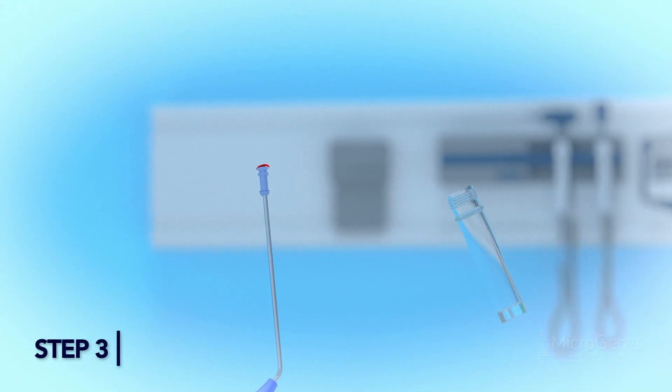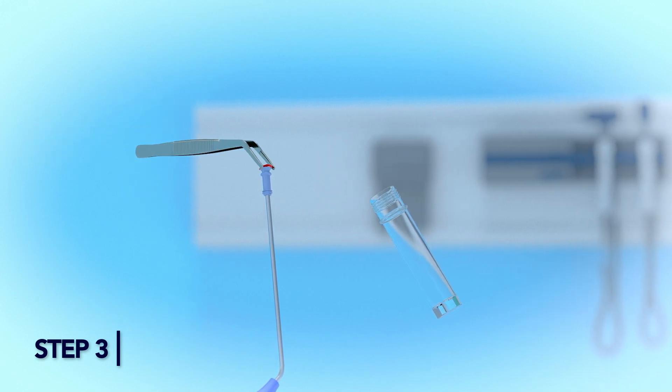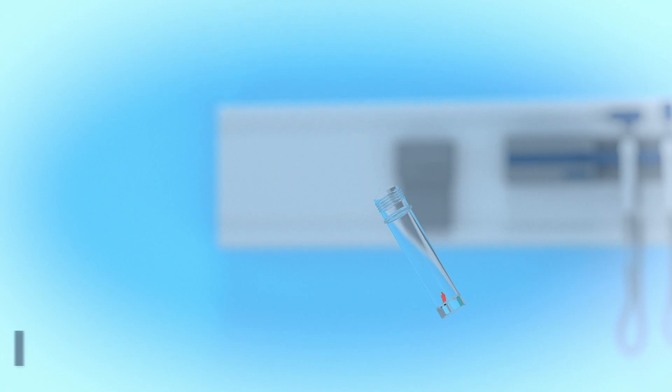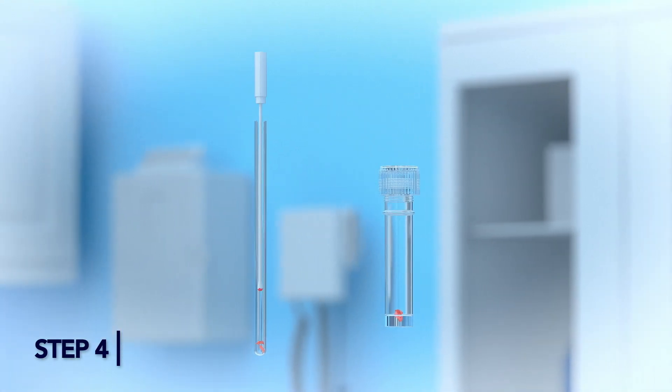Step 3: Add the additional materials collected from the suction device to the swab tube or 2 mL vial. Step 4: Tightly seal the tube and/or 2 mL vial.